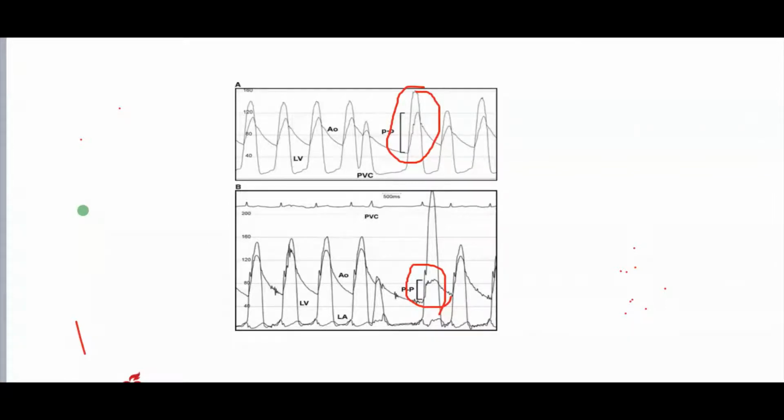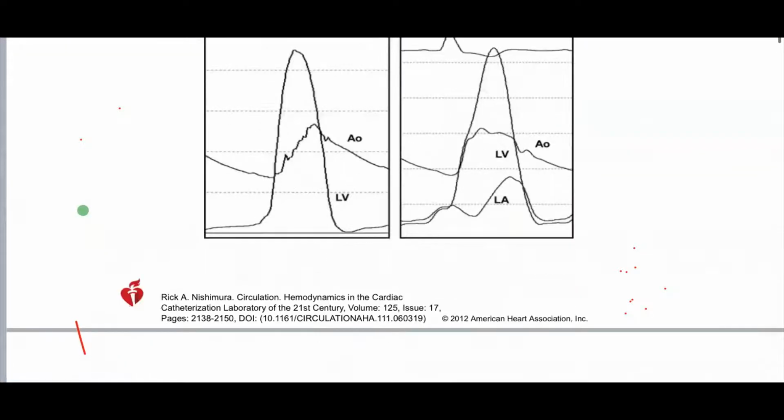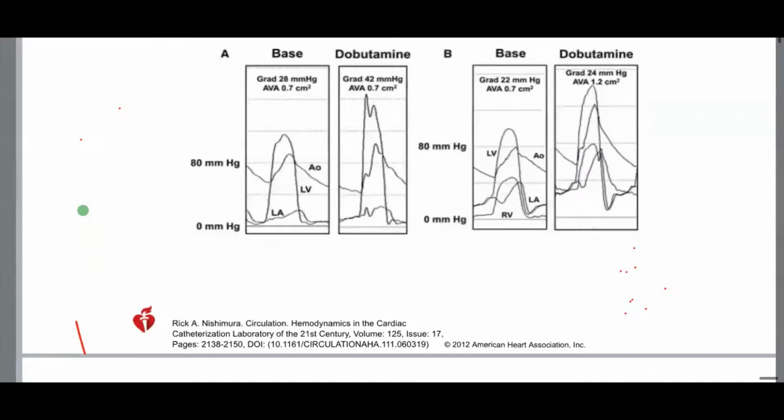What's the full name of this? Brockenbrough. Braunwald something. Brockenbrough-Braunwald-Morrow phenomenon. Yes. Three cardiologists have described it, but the honor just goes to Brockenbrough somehow. Okay, so this is the Brockenbrough sign. Okay, I think we have done this one. Okay, now what do you see here? Show me what you see here.